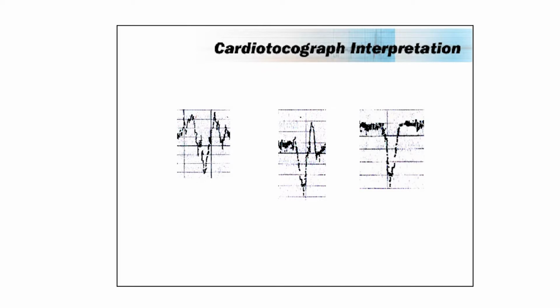So they're the 3 types of shouldering. So this is in your handout. The normal physiological response, the overshoot and recovery, and then the absence of shouldering.